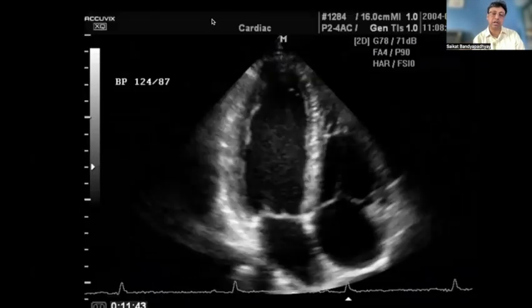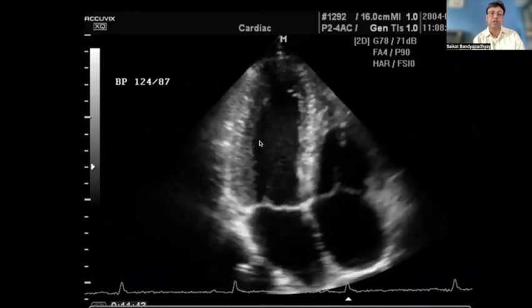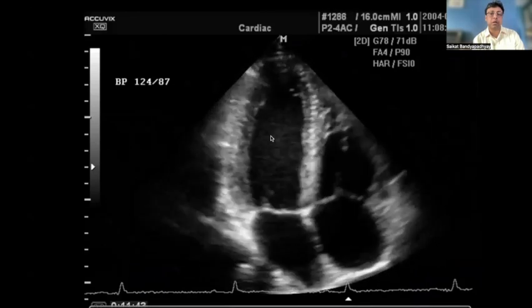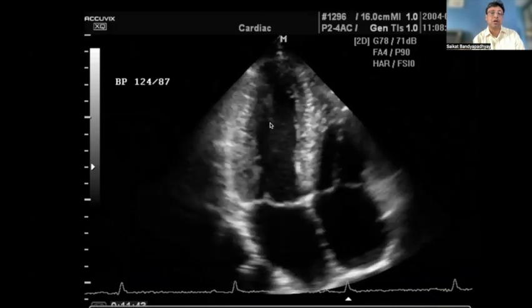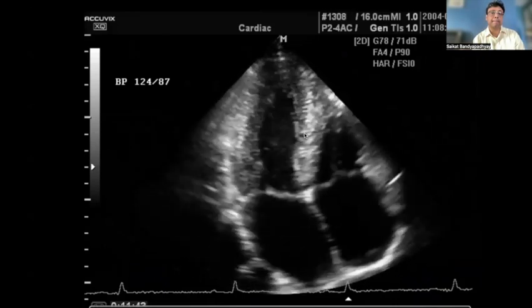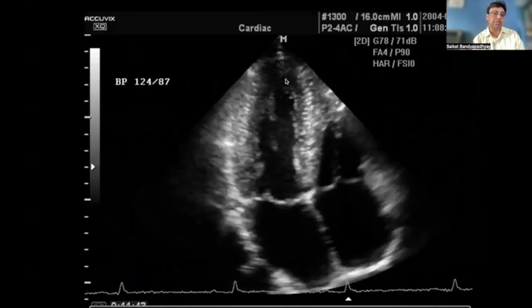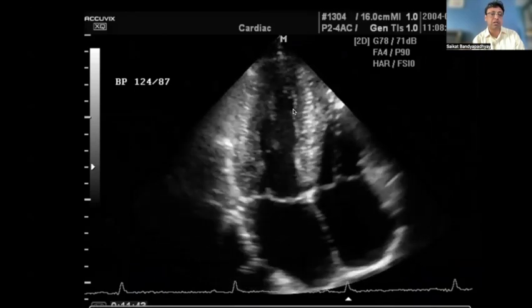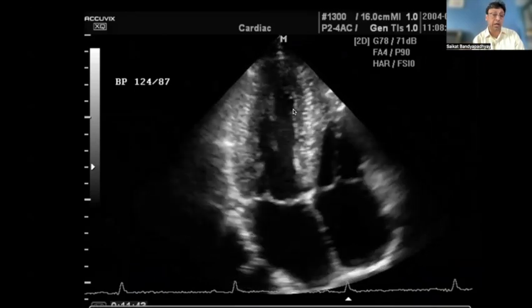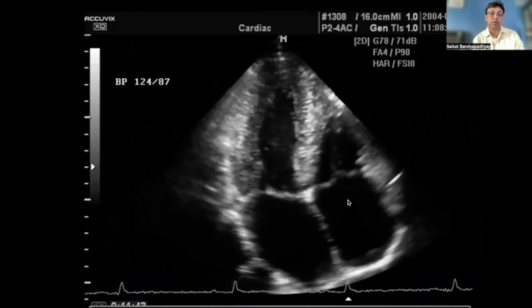So this is again a four chamber view, and in this particular case, what is very markedly different, slightly abnormal, I would say, is that the RV is rather big. So I would definitely have to look for, although the LV is foreshortened, but to me, the RV is definitely enlarged. So I'll definitely have to look for a shunt or some other abnormality causing this left or the right ventricular enlargement. But the valves, the coaptation of the valves look normal to me.